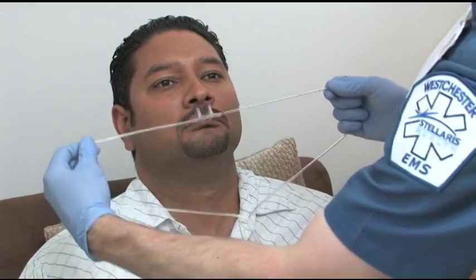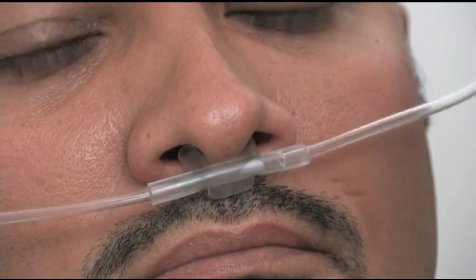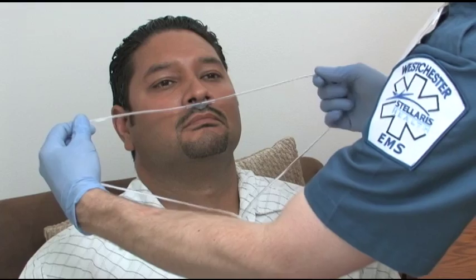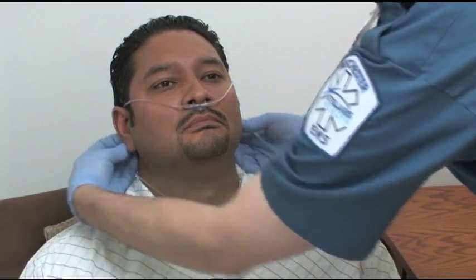Insert the two prongs into the patient's nostrils. Make sure the prongs curve backward and inward toward the patient. Position the tubing of the cannula over the patient's ears. Bring the remainder of the tubing under the patient's chin and secure the slip loop by gently sliding the plastic adjuster in place. Do not make the tubing too tight.